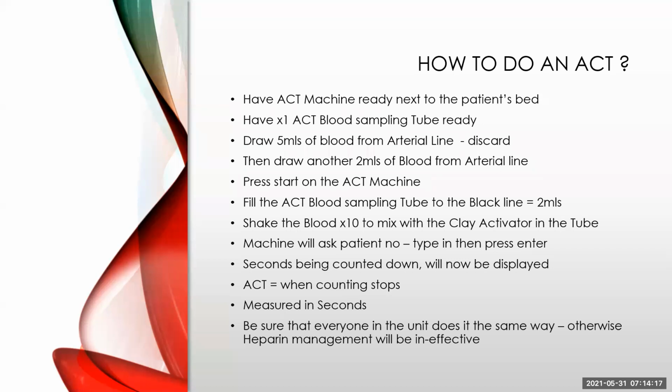And the heparin infusion will be titrated according to the patient's needs. So also do your ACTs for the next 6 hours, I suggest every hour, so that you can see where you are at, and go up with 2 or down with 2 or whatever the case might be, because you don't need a lot of it to actually go into the patient per minute or per hour. So titrate it according to that. And be sure that you know how this works.